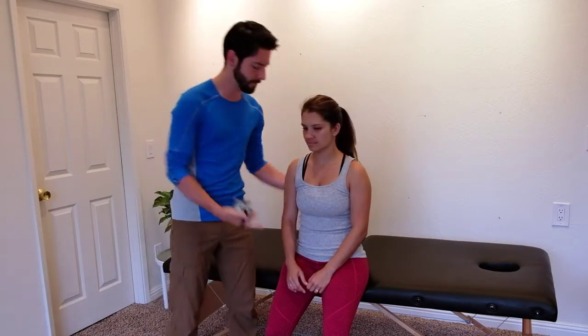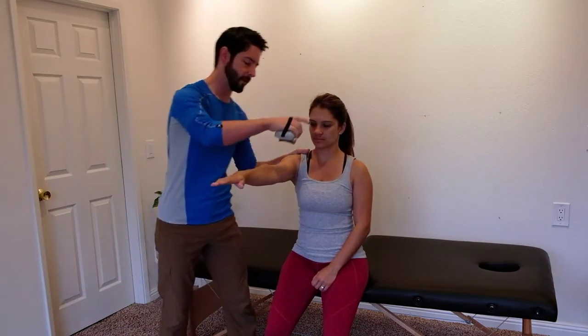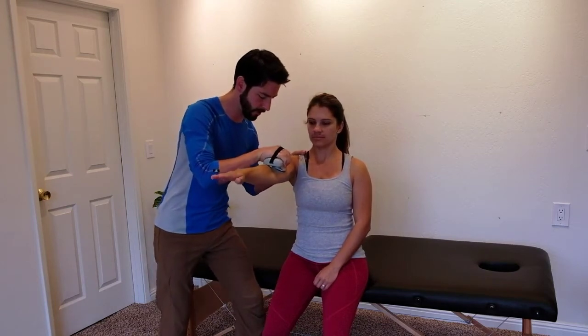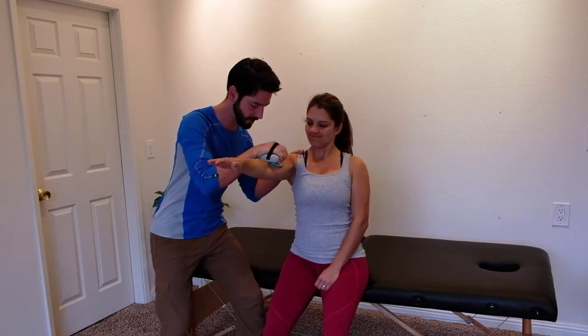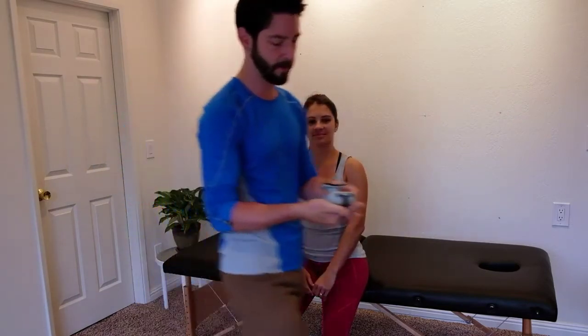Okay, so sit up nice and tall. Arm, have you put it right up here. I'm going to brace your shoulder right here. I'm going to put the device right here, okay? You ready? Push into me. Good. Go, go. Push, push, push. Good. Good. And go. Okay, let's do the other side.